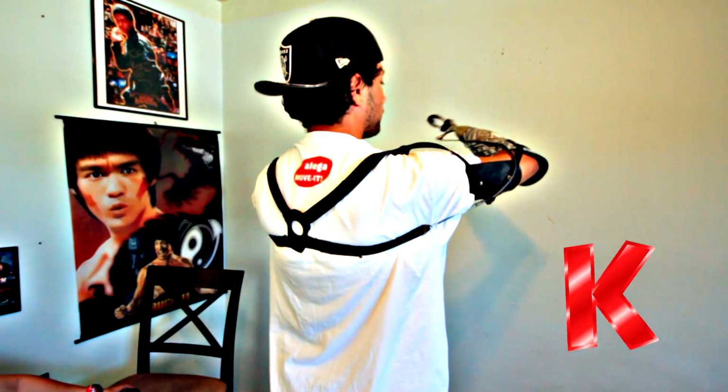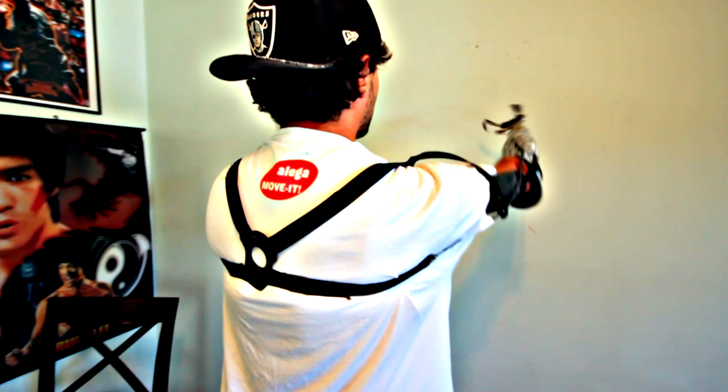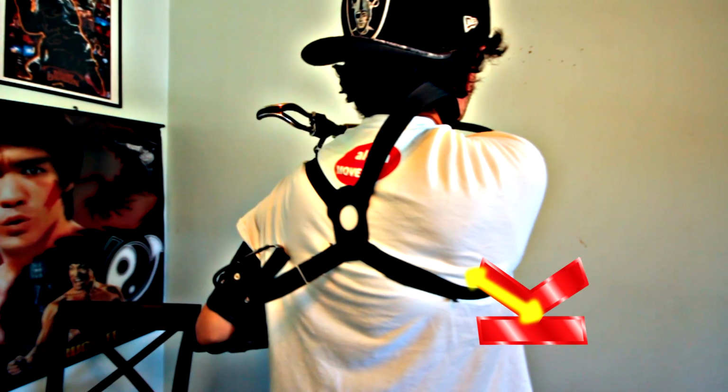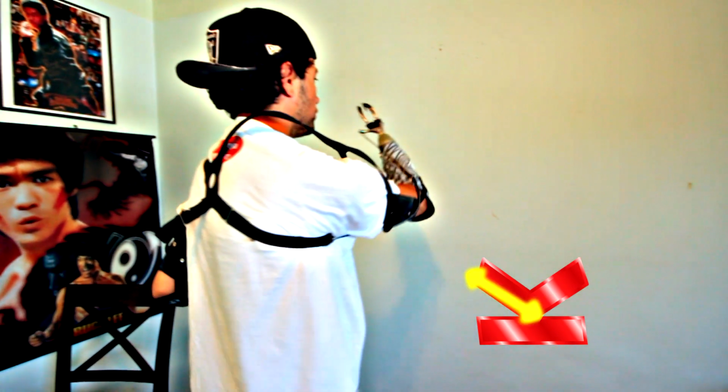So for you guys that are watching that are double amputees, there's a couple of ways you can make this thing open. You can see the bottom of my harness, it looks like a K laying flat, and these two would be the legs of the K. I can open it by making the back of the K tight, but I can switch the tension to this shoulder by pulling this left side back. Now the tension transferred into the leg of the K over my shoulder. Now I can open it like that in a tight place where you can't have room to stretch out.